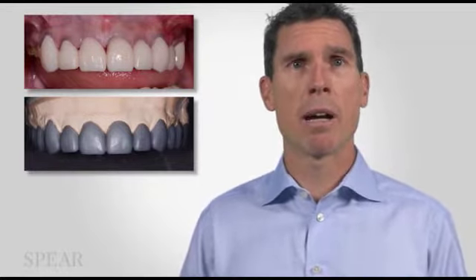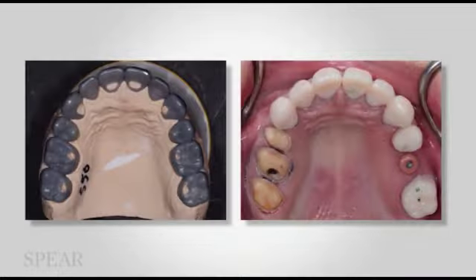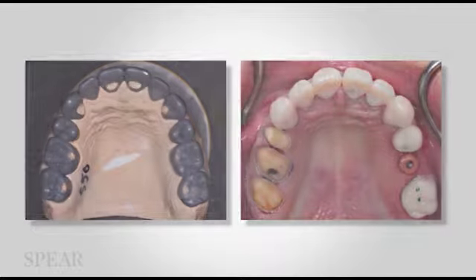That's how accurate these putties are, or that's how accurate CAD/CAM dentistry is. It looked terrible in the mouth, and I went back and I thought, what was the mess up here, Mr. CAD/CAM? And actually, it's because it was so darn accurate. So as you'll see in a minute, I ended up going and changing that and putting some nice provisionals in. But I wanted to bring that to your point that, yeah, that's why those look like that. But regardless, the edges were still where they belong, and the function was great.